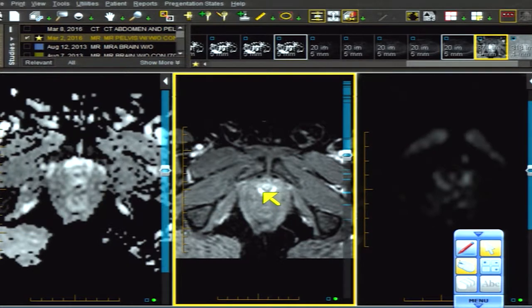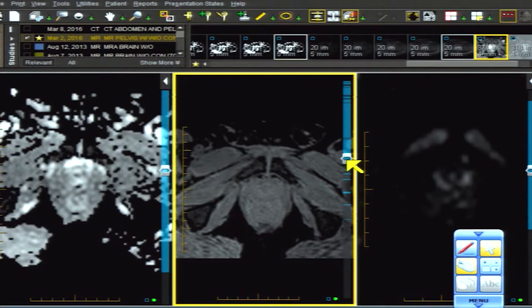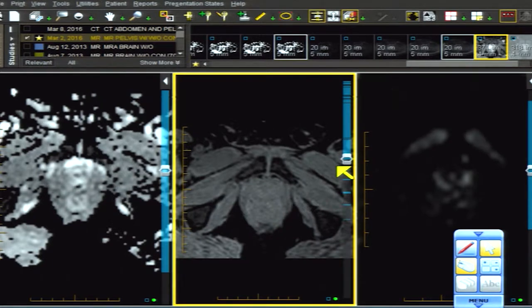Right away we start to see a little bit of asymmetry. You might say, is that enough to be bothersome? Not by itself, but when you affix it to the rest of the findings, yes. Let's go to the next slice — this is the mask before the contrast has gotten there. How fast do we want the contrast to be evaluated? Ideally six or seven seconds per frame — that should be your temporal resolution in the ideal setting.